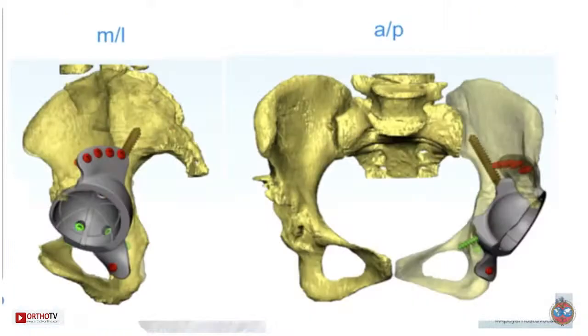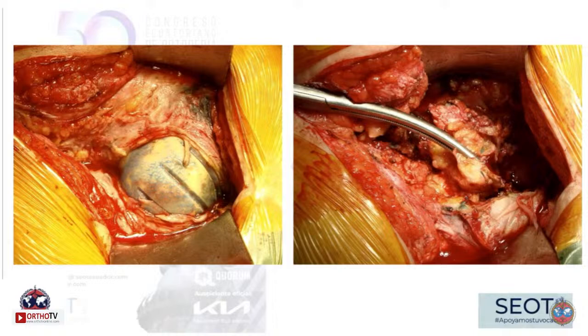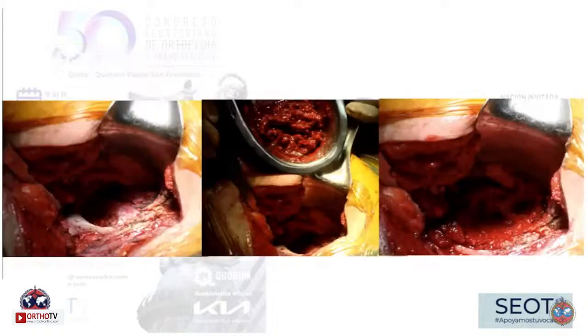In this case, I specifically decided to put some screws down and not to perform the ischial part, even putting screws in the ischium. It's easy in this case, and we work with the engineers to plan this before beginning our surgery, and as I told you, it's like putting in the final piece of the puzzle.